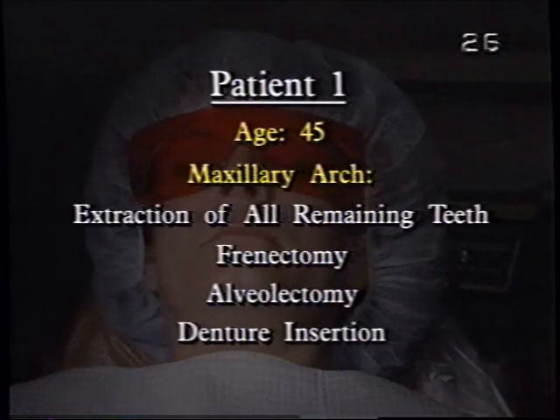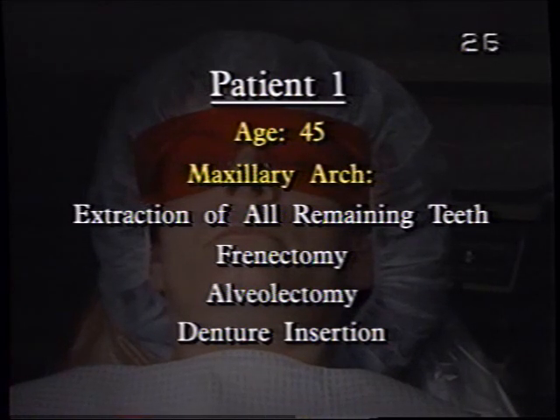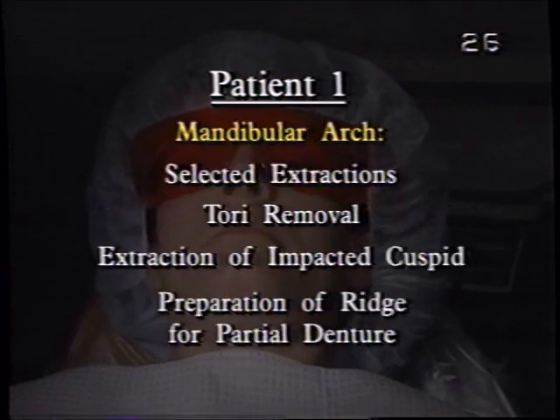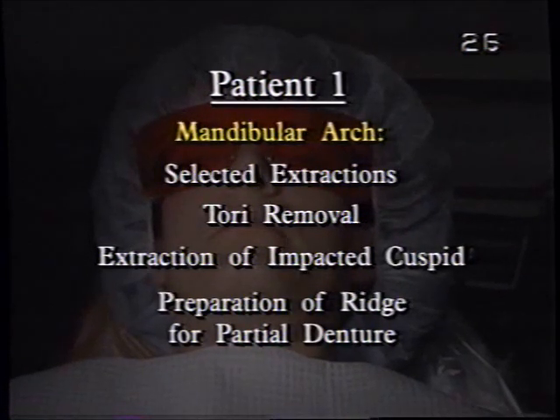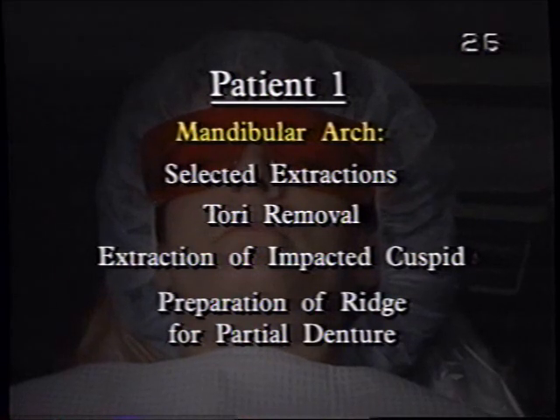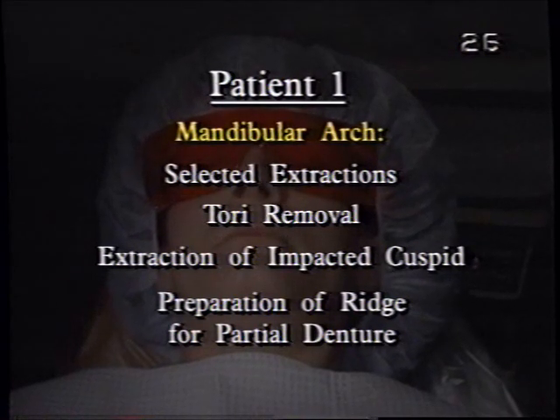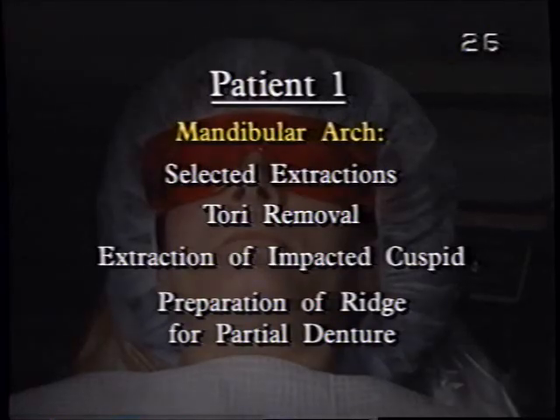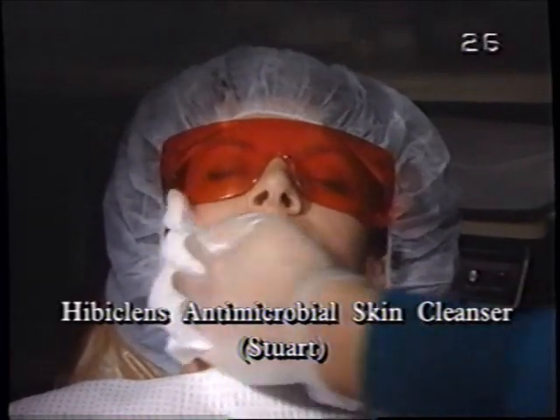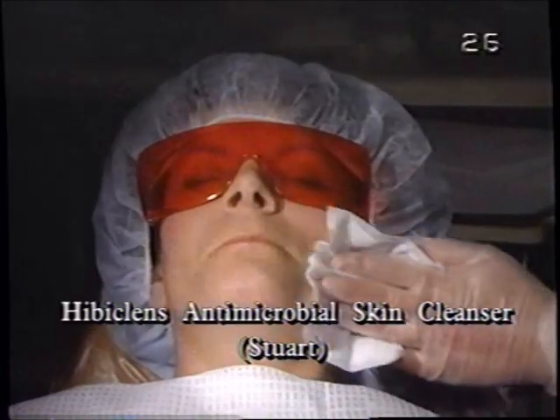We want the face disinfected so that when our gloves touch the face, our instruments touch the face, we're not transferring organisms not indigenous to the mouth, such as staph or other types of bacteria, into the surgical field. So Susan, if you'd go ahead and do that for a couple minutes with the HibiClens scrub from ear to ear, from nose to Adam's apple.